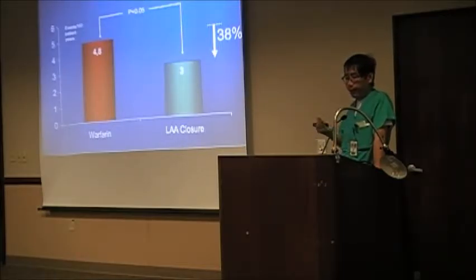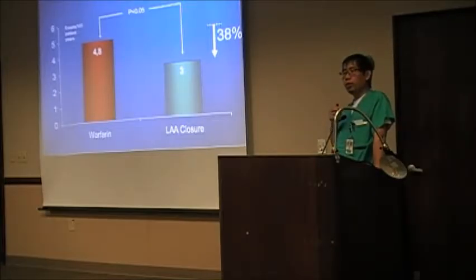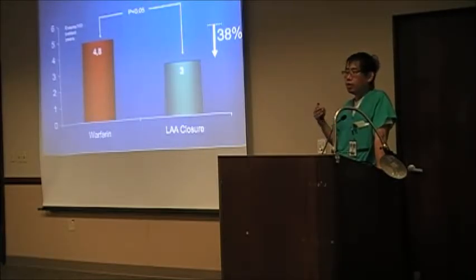And the mortality is decreased about 38%. This is why, when we tried to bring Watchman to East Jefferson Hospital, the company was very hesitant. They try to slowly, step by step, develop some people familiar with the procedure. You don't want a doctor to do this type of device who can only do 3 or 5 cases a year. You want them to do more than 25 or 50 each year. The patient selection is very restricted, so this is why.